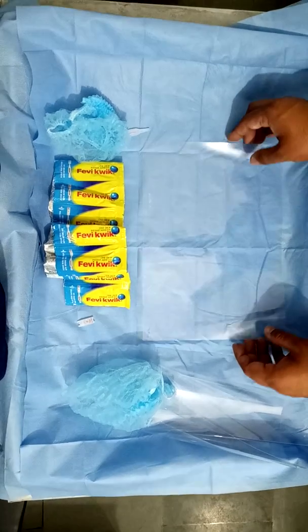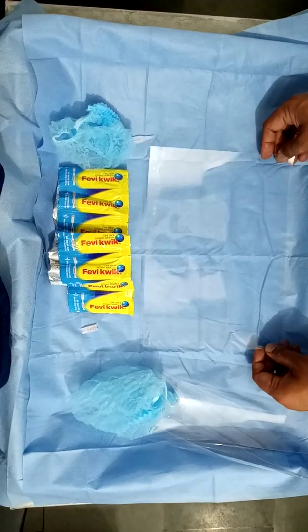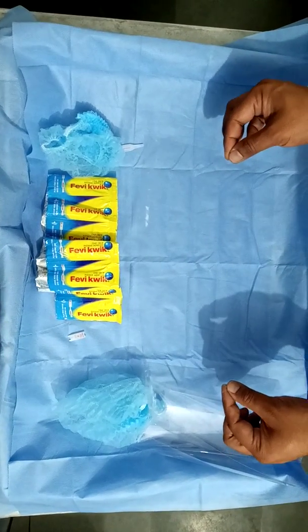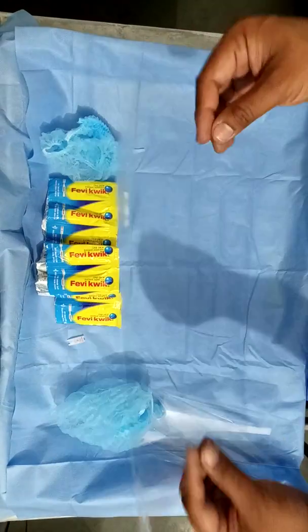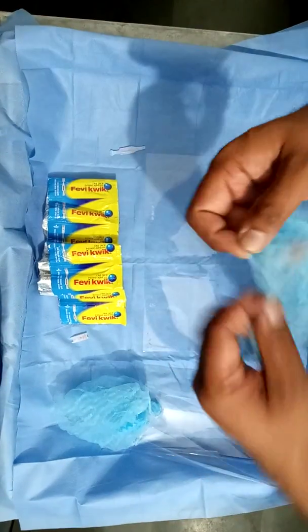Hi guys, I'm Dr. Vishal Rajan Sharma and I'm a retina surgeon. Today I'm going to demonstrate how to make a simple face shield so that we can examine patients with indirect ophthalmoscope. We have a plastic sheet, fevequik, and a surgeon's cap.